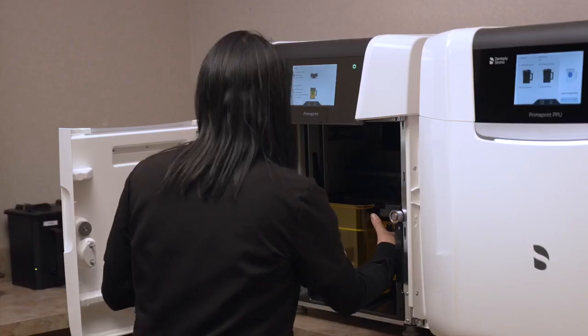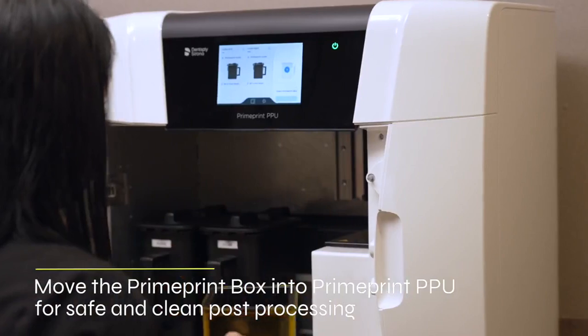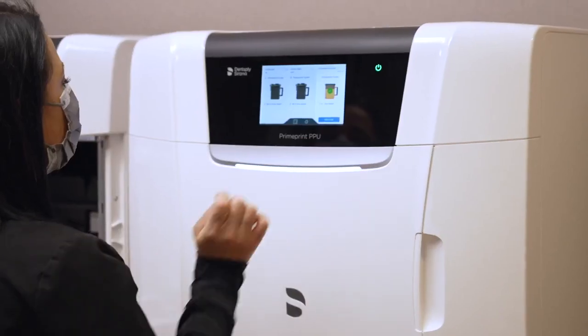Now that the printing is complete, she can transfer the PrimePrint box from the PrimePrint into the post-processing unit for final washing and curing. The greatest thing about this entire process is there's no drippy alcohol — there's no resin. It's completely and totally dry.